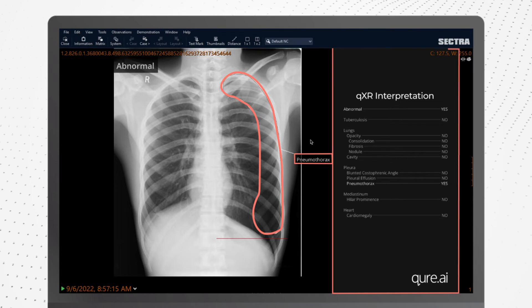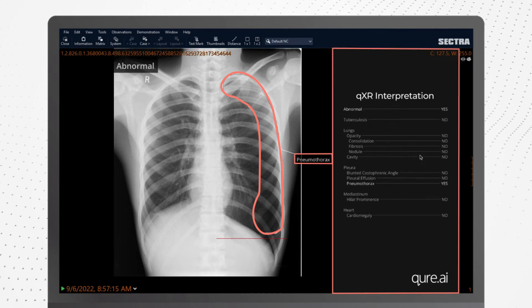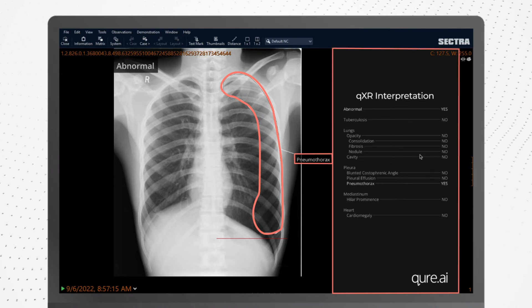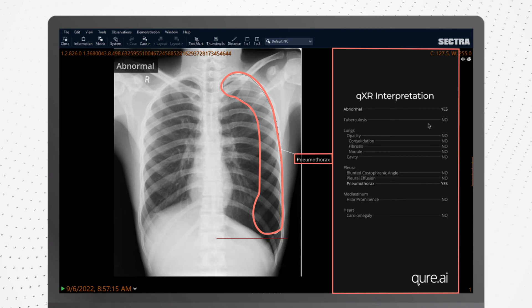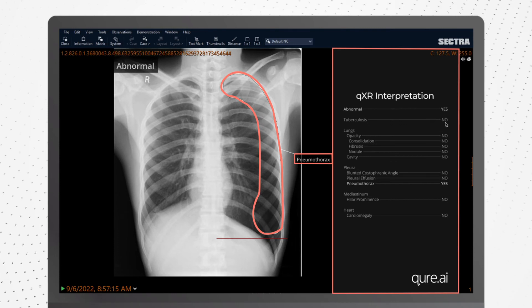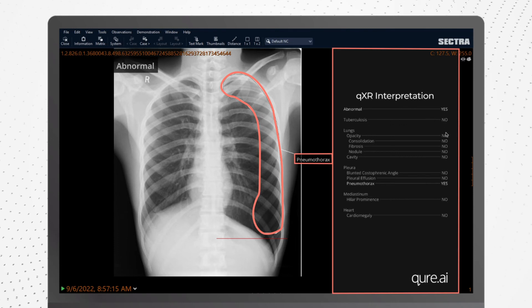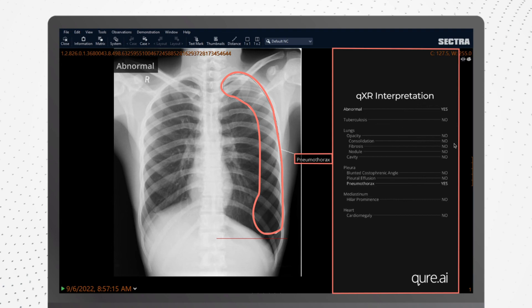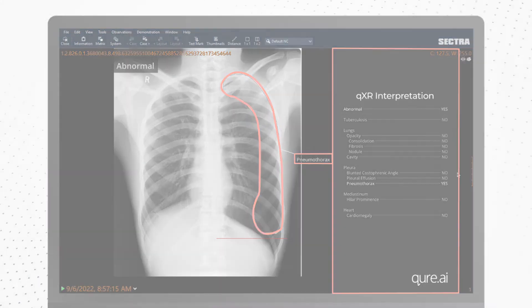The QXR report consists of a table with a list of findings, with a remark as yes or no, indicating presence or absence of the abnormality, and a free text report with locations of these abnormalities along with respective scores.